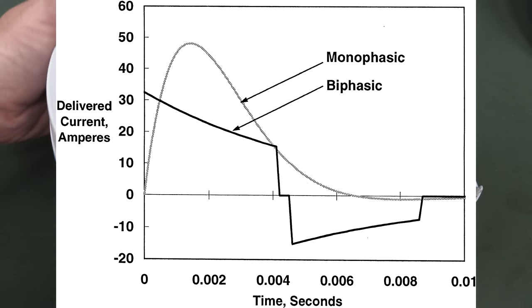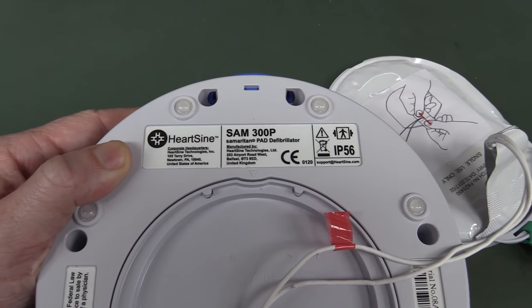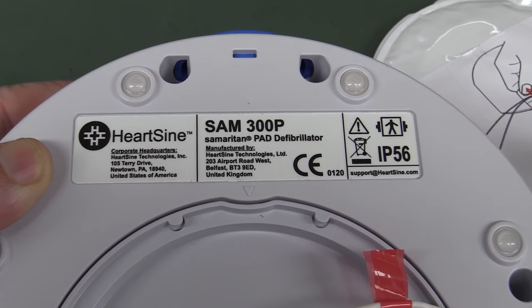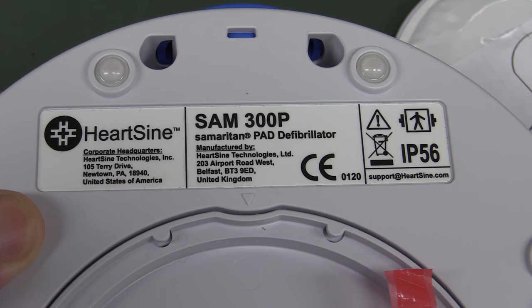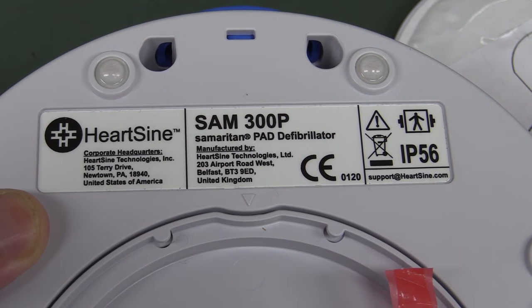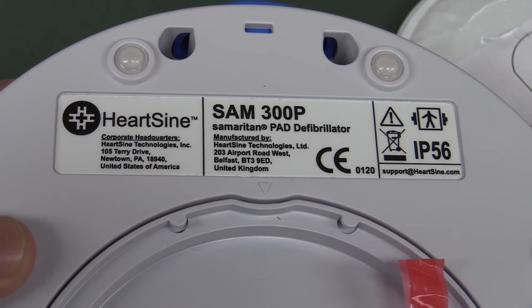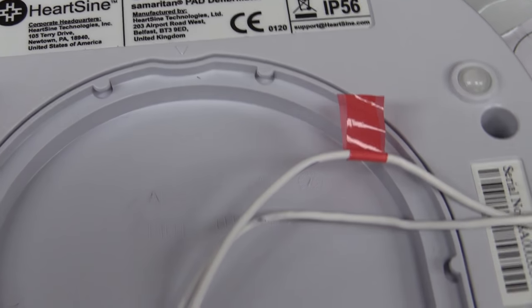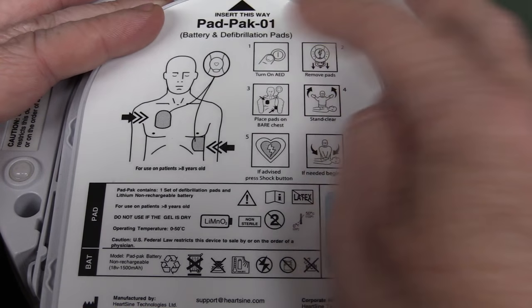And for those playing along at home, this is the HeartSine Samaritan PAD SAM300P manufactured by HeartSine Technologies Limited, basically in Belfast in the United Kingdom. So hi to all my Irish viewers! And there are the instructions on the back on how to use it — turn it on, remove the pads, place the pads on the bare chest, stand clear if advised, press shock button.